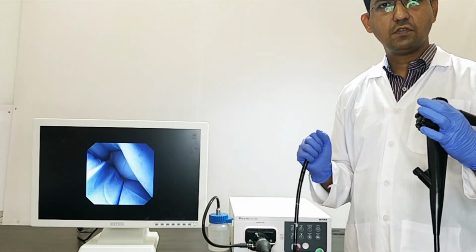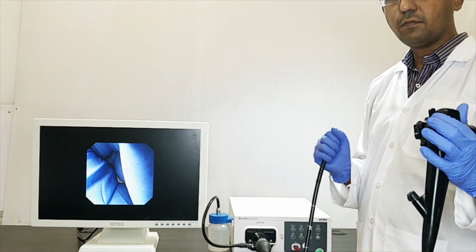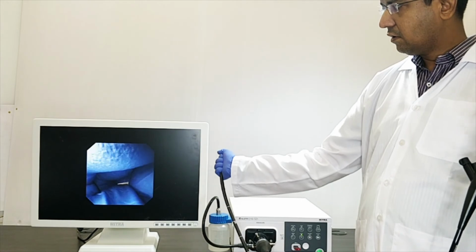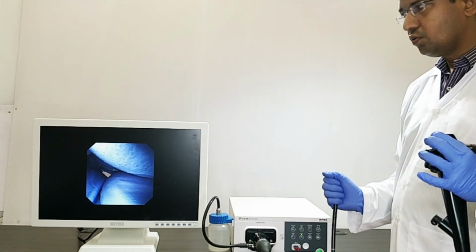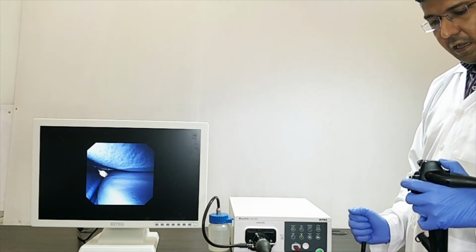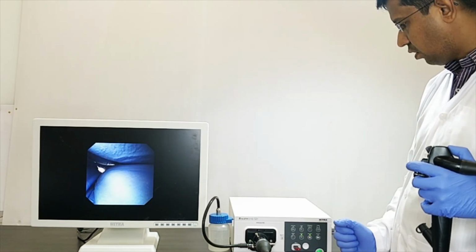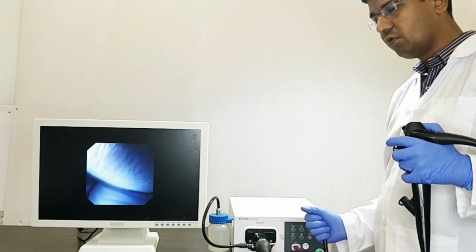There are 3 remote switches on this video endoscope. If I press switch number 1, you can see that your image freezes. If you press it again, it starts moving again. Then I am pressing switch 2. This switch 2 is to set enhancement settings, and if you press switch 3, it records your still image. You can see the LED goes on and now off. That means your image is directly saved in your pen drive.